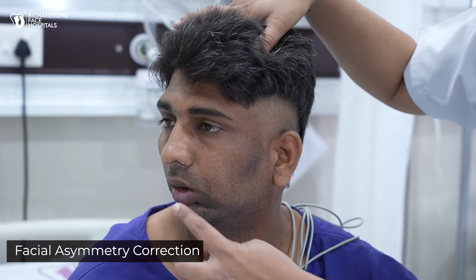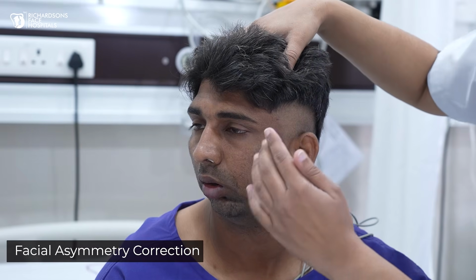Ek baar turn kariye please. So if you see from here, the profile is convex, straight, where the lower jaw is retruded.